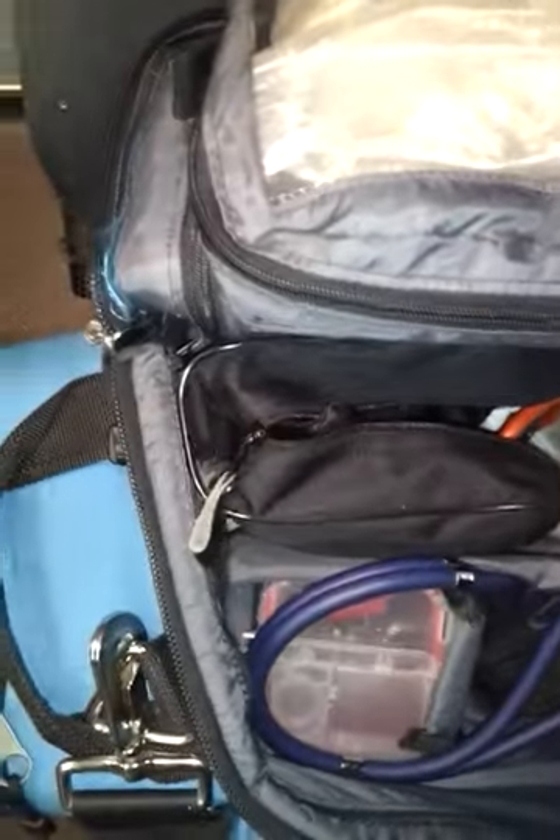There's a sharps container in there. It's a blood pressure kit — it's kind of a mess right now. We've got adult, large adult, and child cuffs.